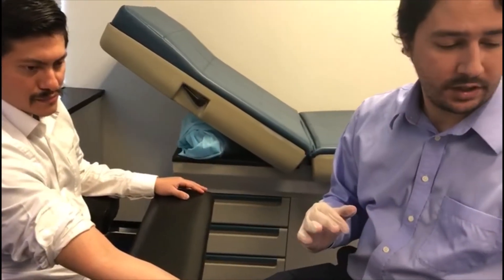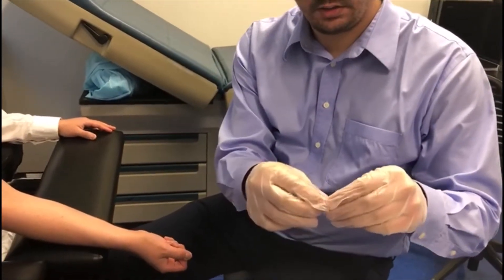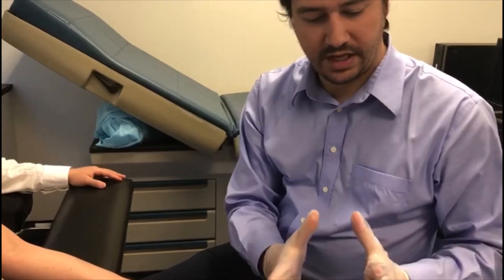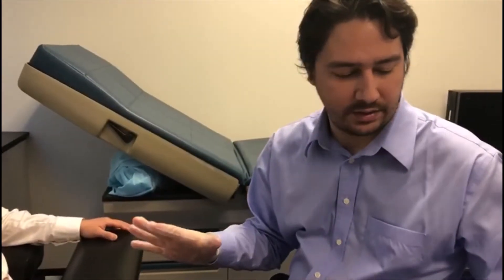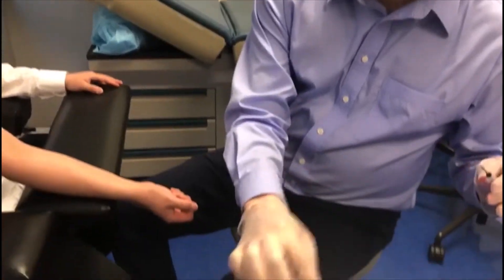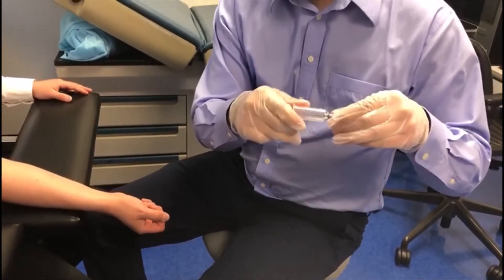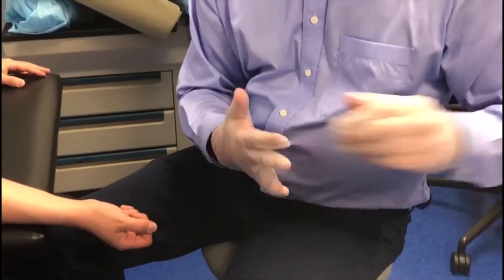As it's drying, I'm going to take one piece of gauze and wrap it — one, two — nice and tight. If you look, it's getting smaller, thicker. It's going to make things easier as far as preventing any blood from getting on his nice white shirt. Set up the needle, have your vacutainer here, sheathed in, screw right in. Make sure that the safety device is up, then put the needle back down.